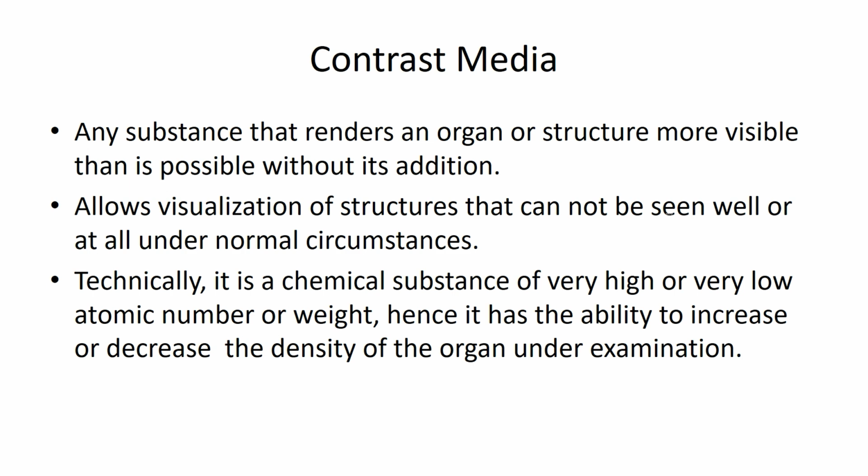Now to go in detail, let us know what contrast media is. It is a kind of substance that renders any organ or structure to be visualized better, without any other mode of picturization.